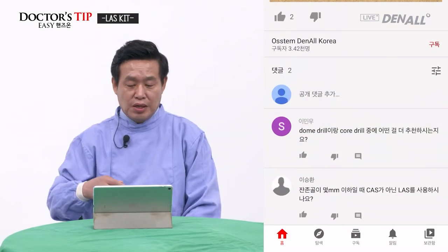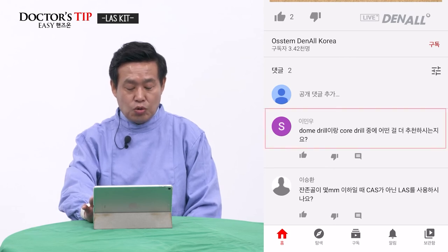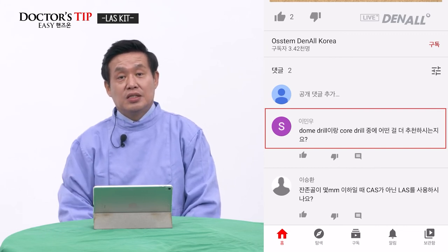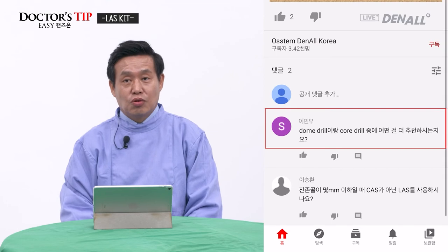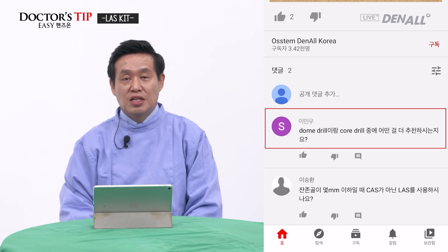Now let's answer some questions. We have two questions. The first one is about the dome drill and core drill, which one do you recommend more? In my opinion, I personally like the core drill more, because the core drill itself is the same in terms of design as the CAS drill, reducing damage of the sinus membrane. It can form the lateral window, detach the window, and then position it back afterward. So that's why I opt more for the core drill.